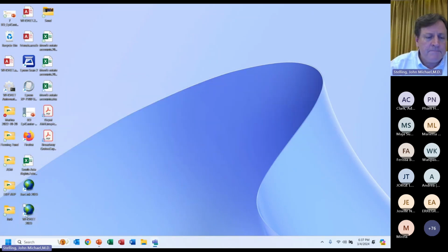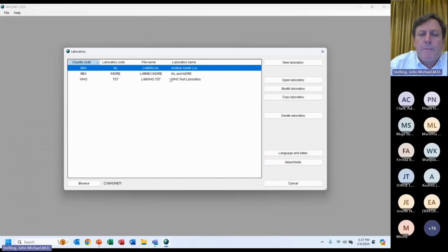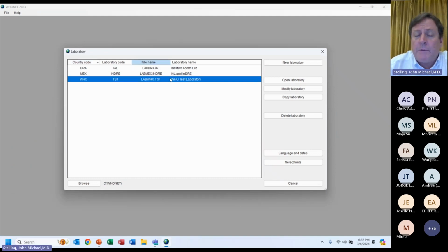Okay, where's my WHONET? Okay. So for purposes of today's demonstration, I will choose, as always, the WHO test laboratory. As other people know, I can change it to Spanish, French, Chinese, so there are many languages here.